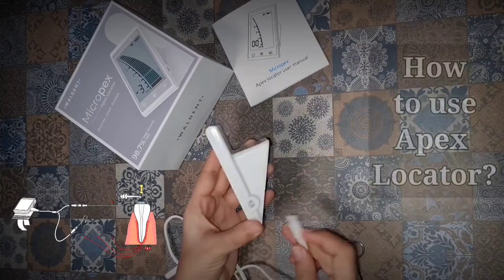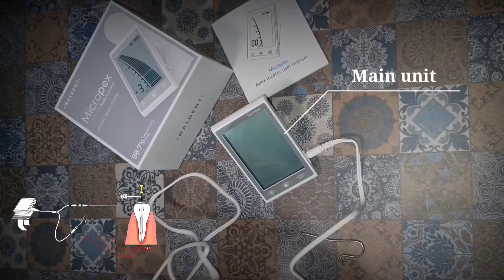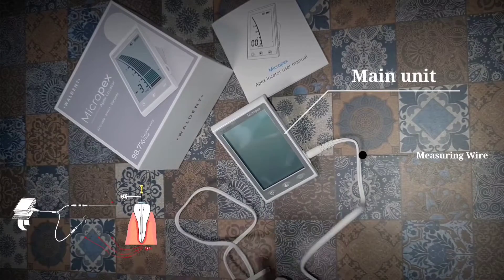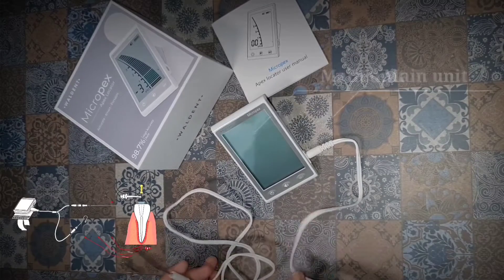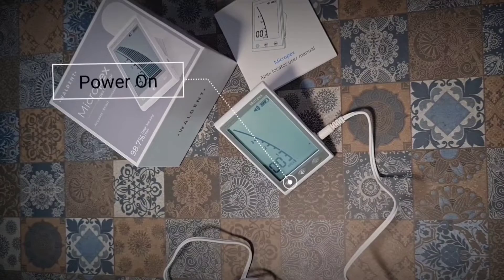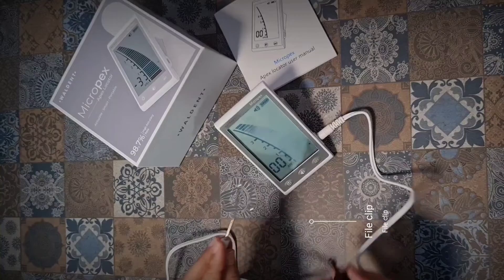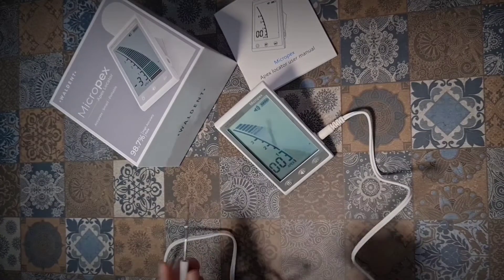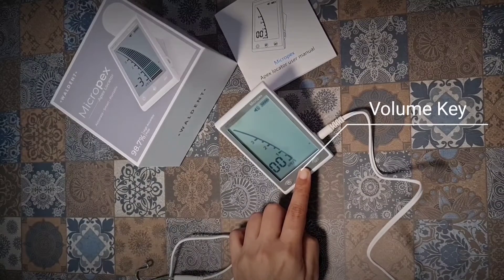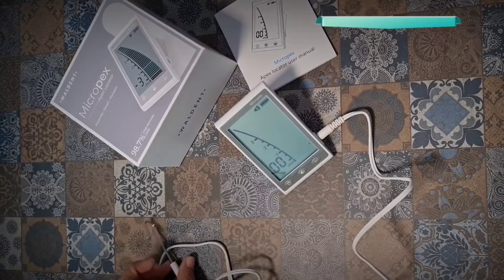To use an apex locator, plug the measuring wire into the socket of the device. Insert the file clip and the lip hook to the other end of the measuring device. Short press the power button to turn the device on. Press the volume button to set different volume settings. Attach the parts, then touch the file clip to the lip hook — that creates a short circuit.